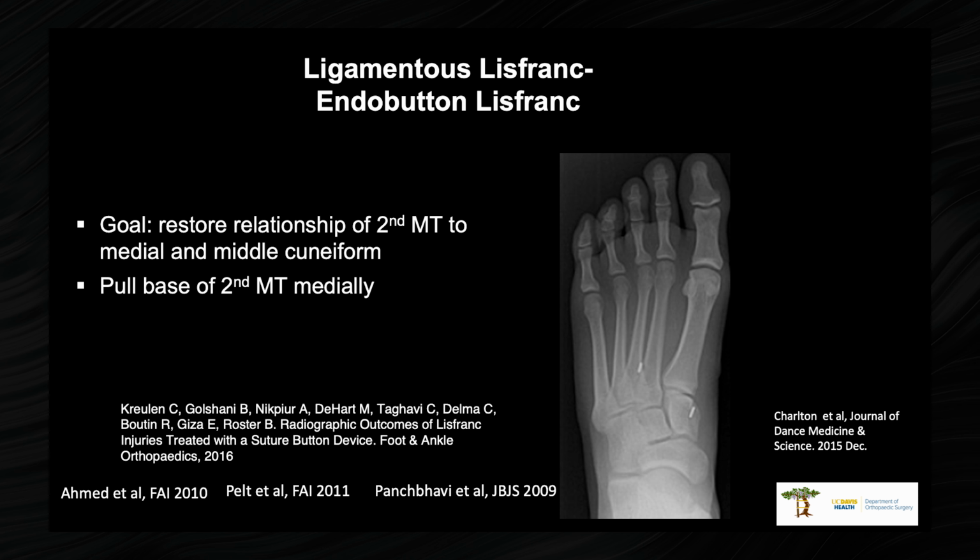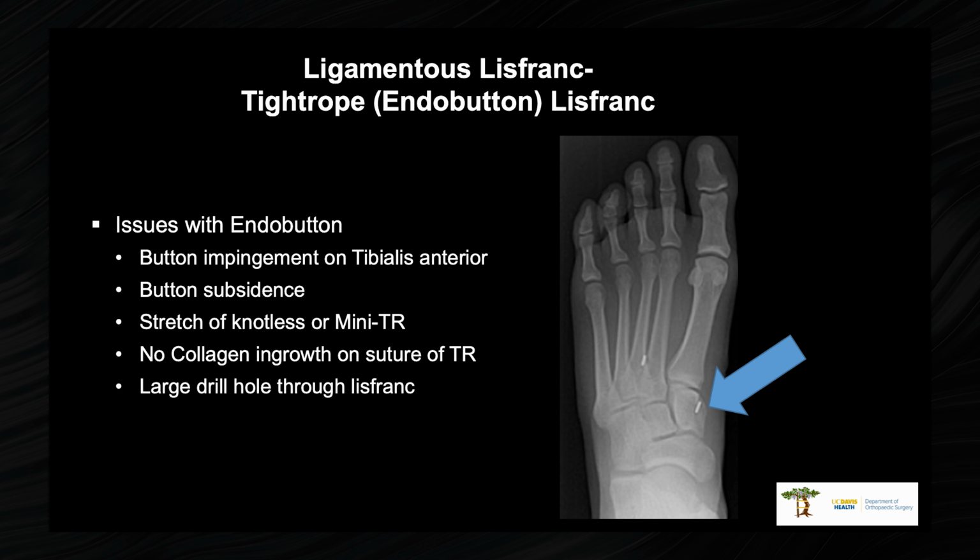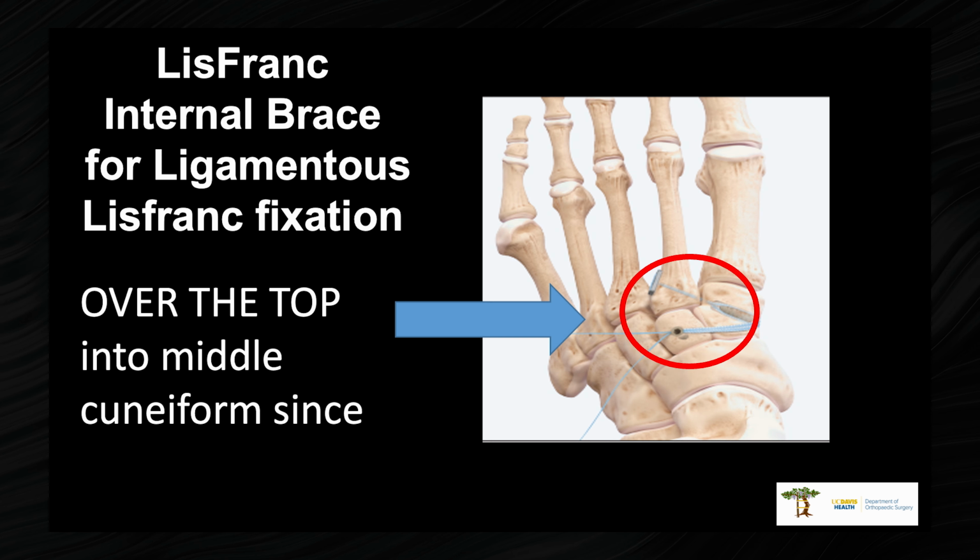And so, as I mentioned earlier, there was the tightrope, which is a great thing, but we looked at our results early on, and we saw that there was some creep in the tightrope. And of course, with the InternalBrace, there's a much better fixation. And then there's collagen ingrowth. And then since then, we've kind of taken it to the next level with putting it over the top. And what I mean by that is doing some fixation of LisFranc itself, but then also fixing the intercuneiform and giving this construct a little bit more stability.